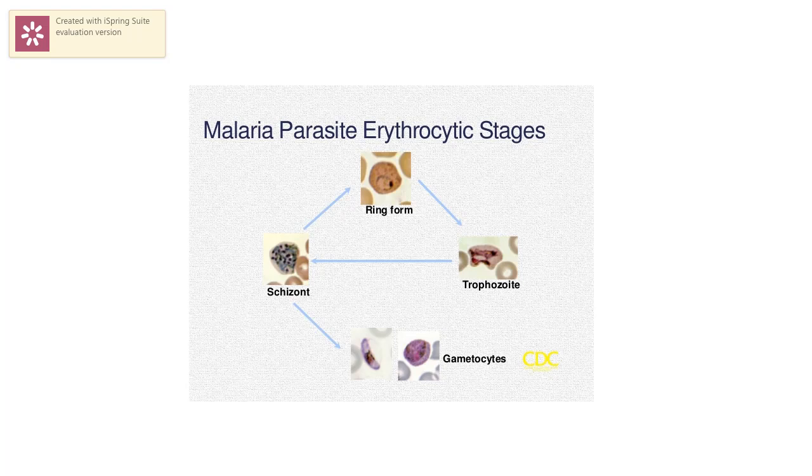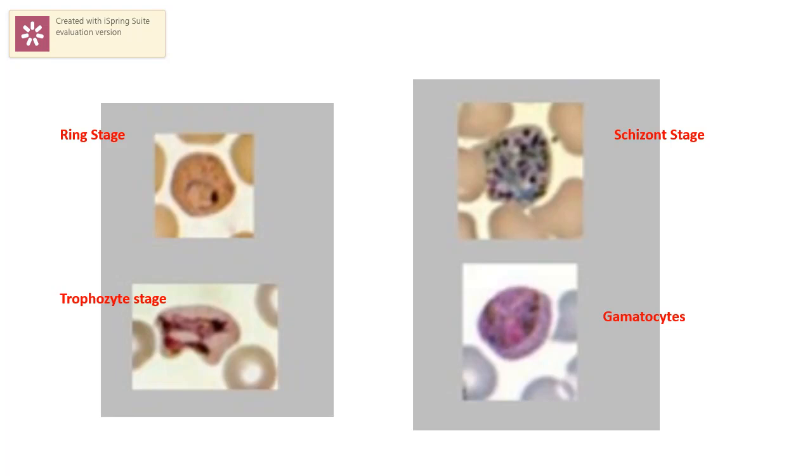And finally, you have the gametocyte stage, with gametocytes emerging from this parasite, and you can see it shows more proliferation and growth in the RBCs. So this is the magnified image of the earlier slide, where you can see magnified images of different stages which you observe under the microscope.